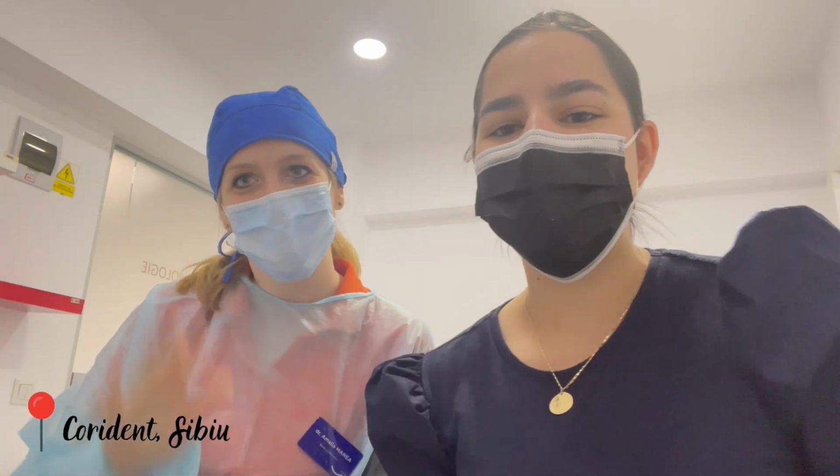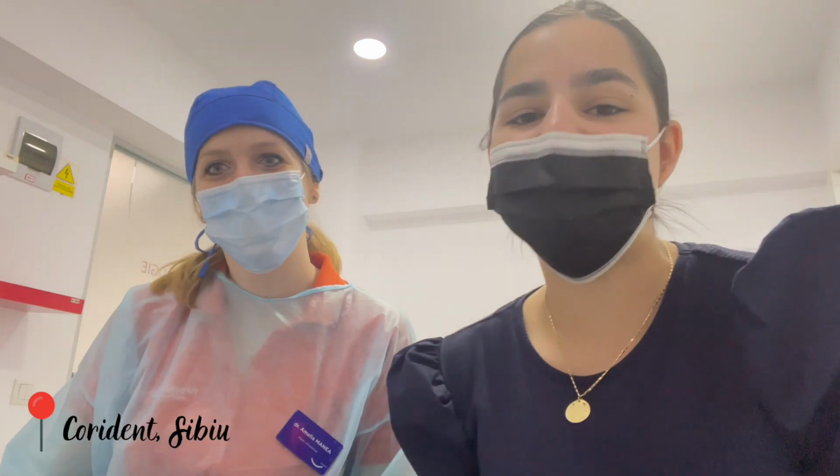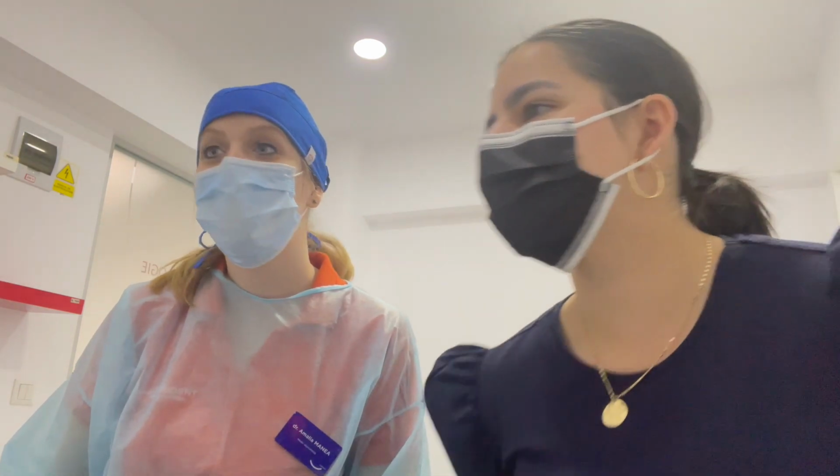Hey guys, so she's Dr. Amalia. She's working here. Hello. And she's gonna make now a surgical guide for a patient to place 2 implants, right? Yes. 2 implants, and we will show you how we make that.